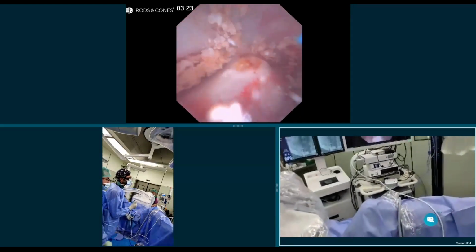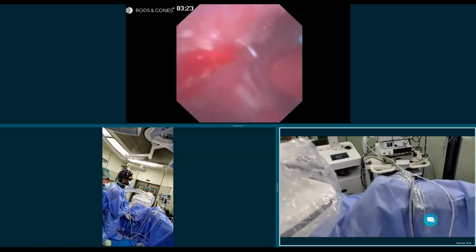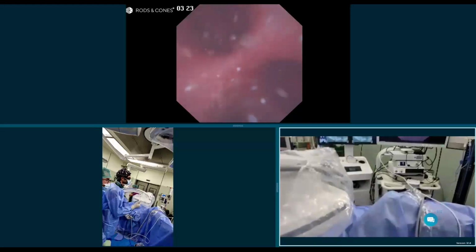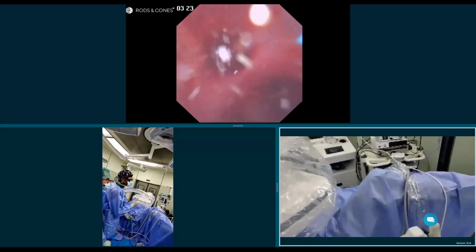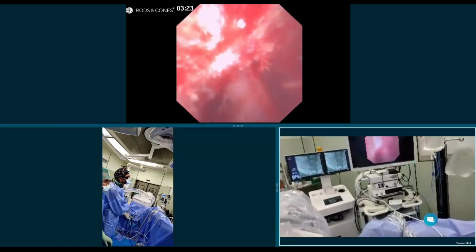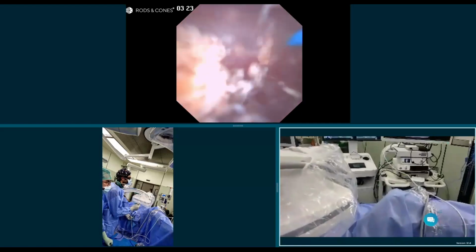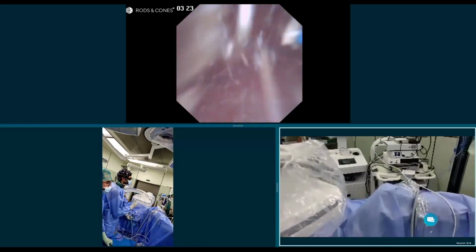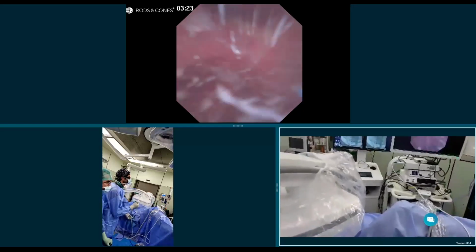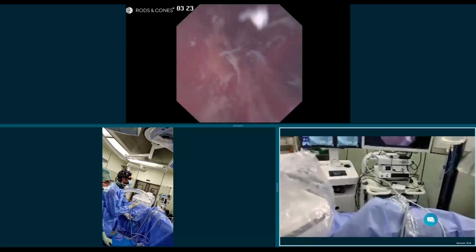Excellent. I'm very happy with the result. I'm going to check the lower calyx here. Excellent. So this is a very easy kidney. I don't need extra X-ray for this. We have done only one initial just to test the C-arm. No excessive X-ray. So this is very important. We have checked all the kidney.